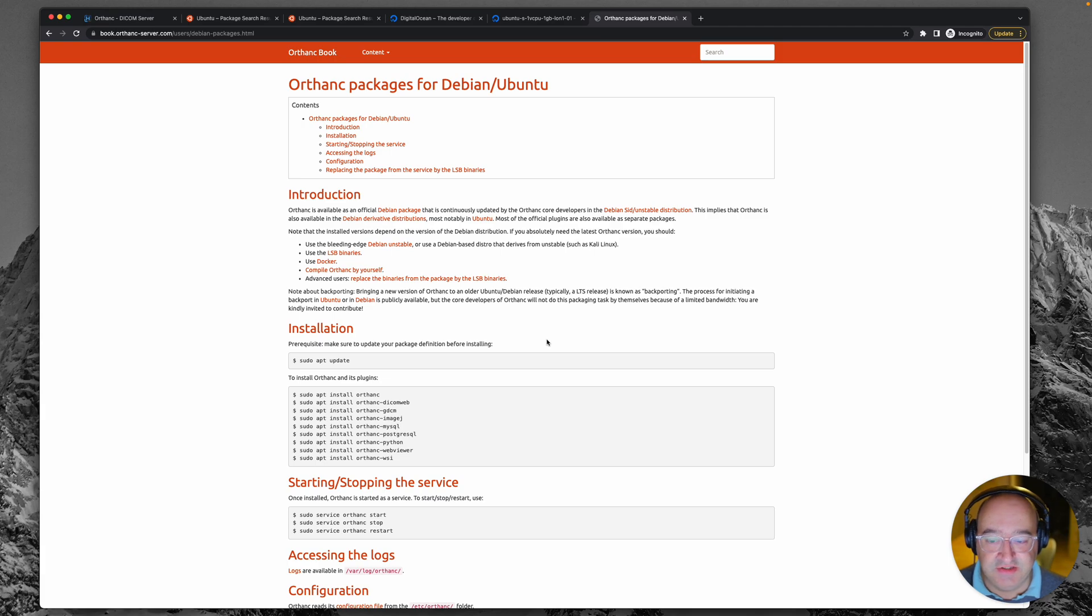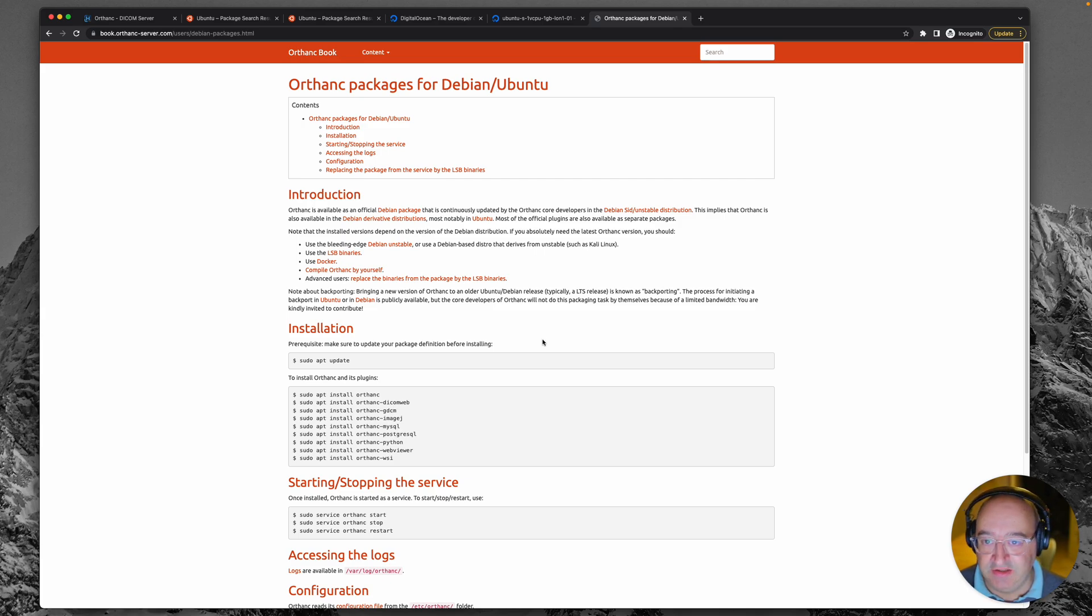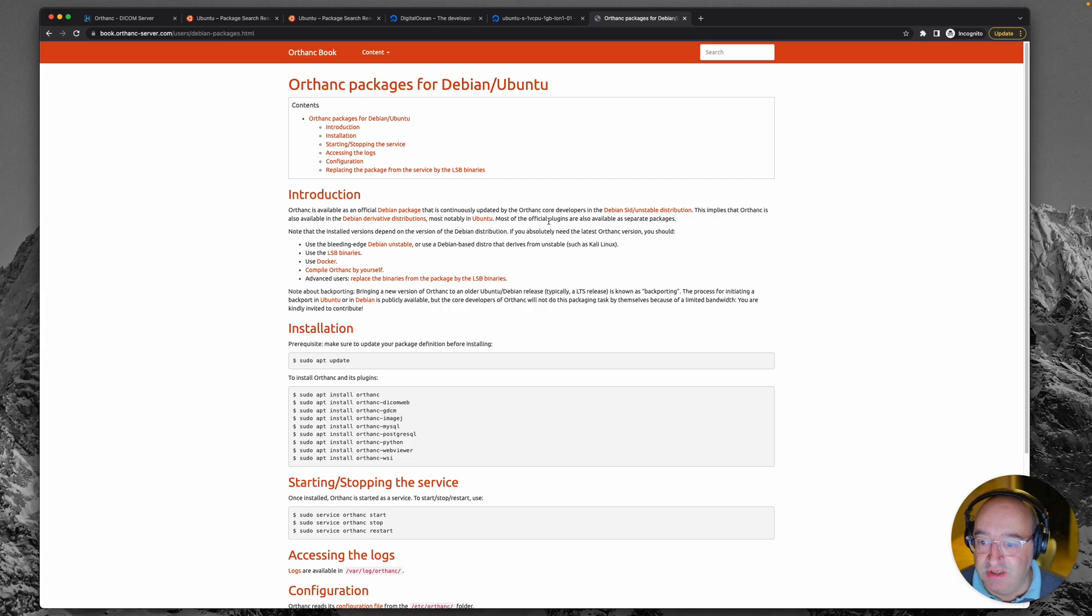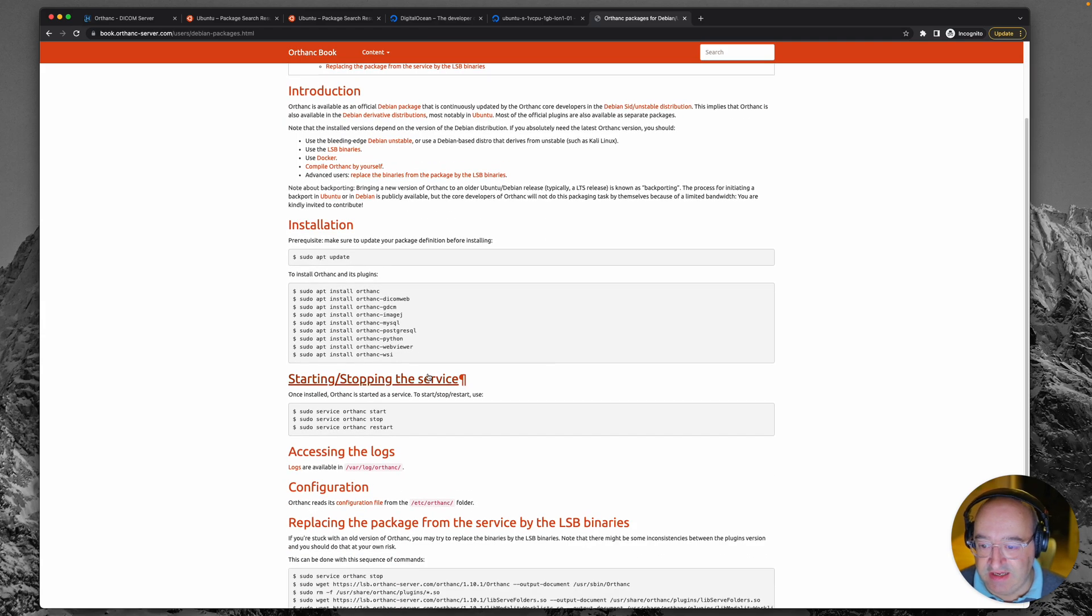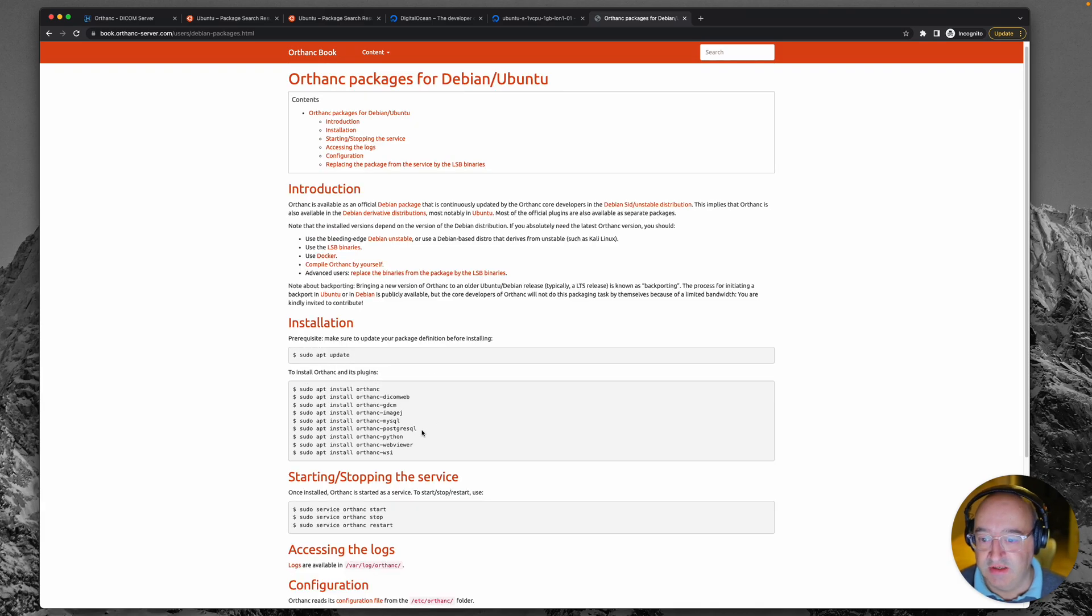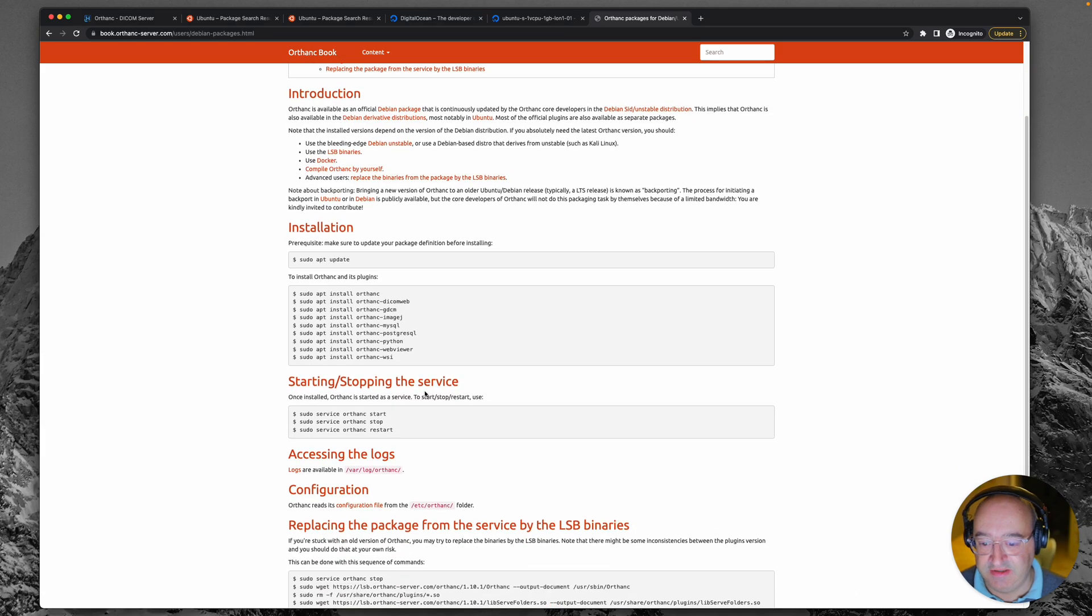So what I've actually done here is just jump to the Orthanc book. This is an amazing resource. It's an online manual that shows you everything to do with Orthanc and if you go to the section in the book about Orthanc packages for Debian slash Ubuntu, it conveniently has a list of all of the packages that we need to install. So I'm actually going to copy these commands and paste them in and they'll make life a bit easier.